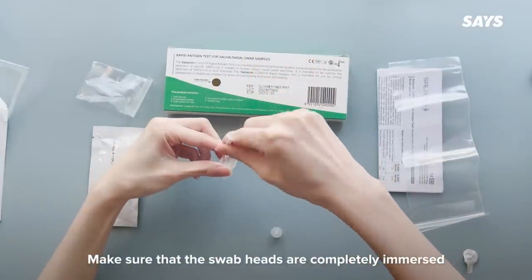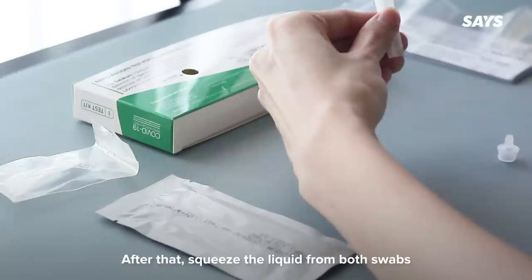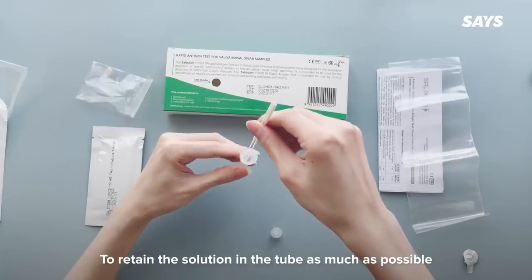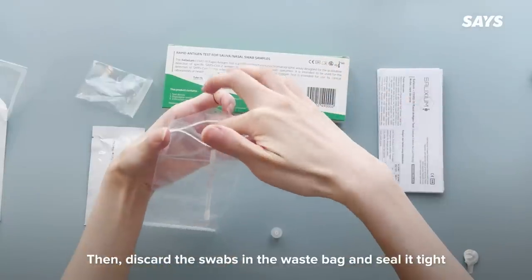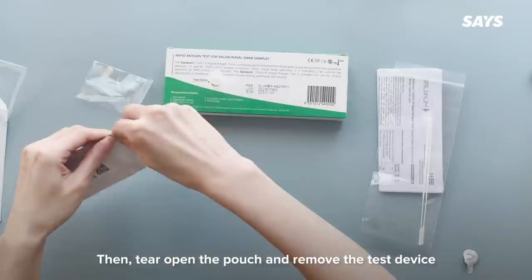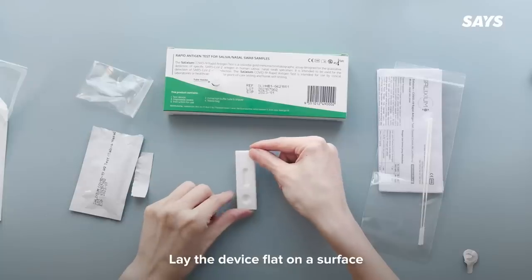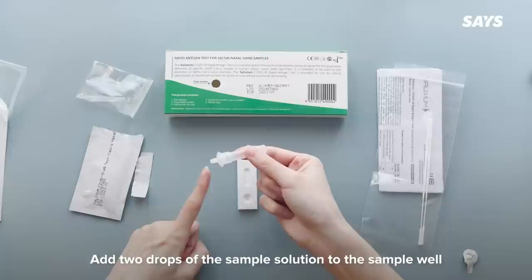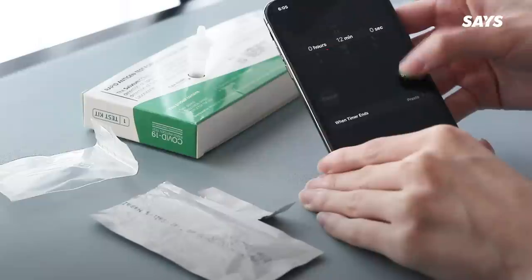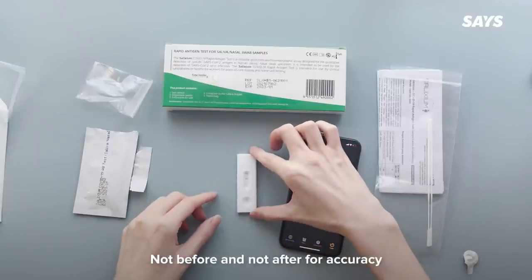Make sure that the swab heads are completely immersed in the liquid inside the tube and mix it vigorously for at least 10 times. Then squeeze the liquid from both swabs to retain the solution in the tube as much as possible. Discard the swabs in the waste bag and seal it tight. Cover the tube firmly and mix the sample solution thoroughly. Tear open the pouch and remove the test device, lay it flat on the surface and label it if needed. Add two drops of the sample solution to the sample well, ensuring there are no air bubbles. You must read the results within 10 to 15 minutes — not before and not after — for accuracy.